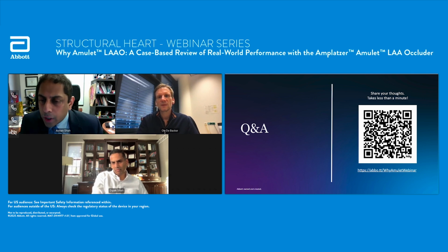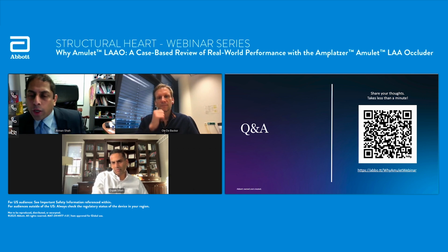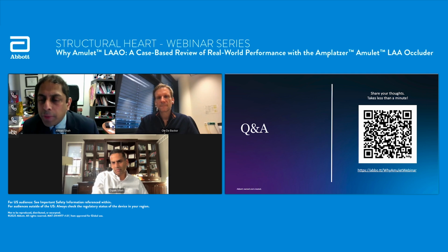Awesome, thank you. Another question from the audience is, do we need to be coaxial between the disc and the lobe for stability, or is some angulation acceptable? Dipak, do you want to attack that one first? Yeah, I think some angulation often, if you're doing a sandwich technique or something like that, sometimes leads to that depending on things. But getting back to what you both had said, for the people who are implanting this device or starting to implant this device, number one, coaxiality on this is imperative.